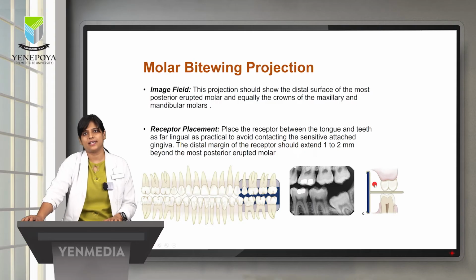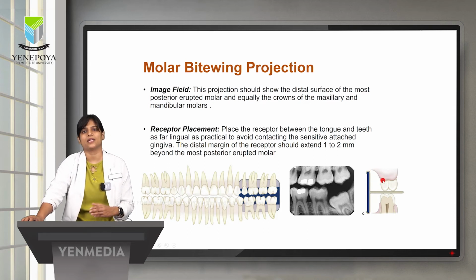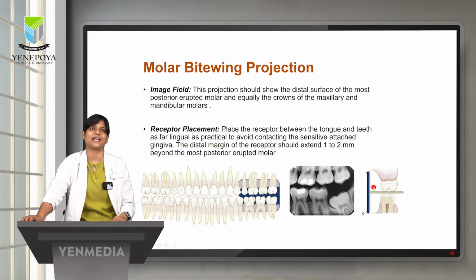And again, slight distance should be maintained, same concept, lingually, so that the palatal bone does not push the film down. And also this area tends to be a little sensitive for the patient, so that also prevents any pain on the patient as well.